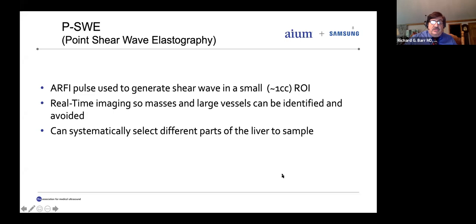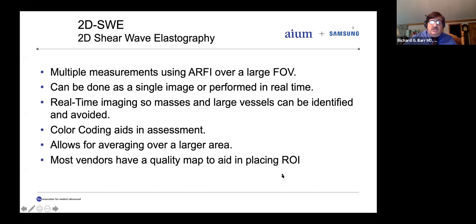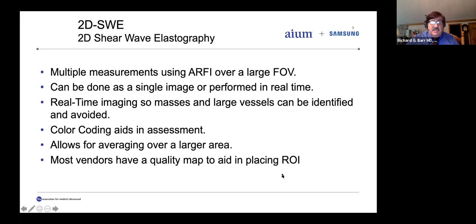Point shear wave uses an ARFI pulse to generate shear waves in a small, approximately 1 cc ROI. We have real-time imaging, so masses and large vessels can be identified and avoided, and we can systematically select different parts of the liver to sample. In 2D shear wave elastography, we take multiple measurements using ARFI over a larger field of view. This can be done as a single image or in real-time. Color coding on all the different vendors allows an overview by looking at the color map, and it also helps in assessing where to put your ROI. Most vendors have a quality or confidence map that will help avoid artifacts when placing the ROI.